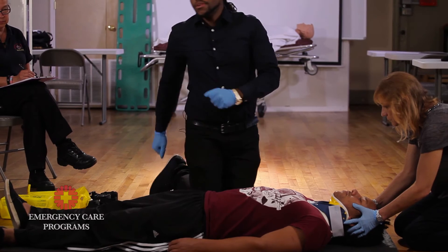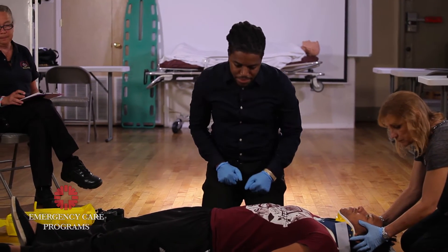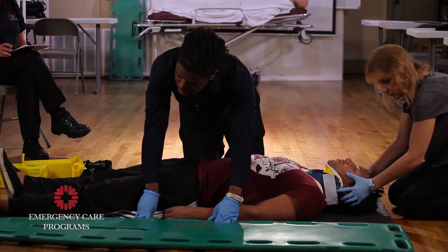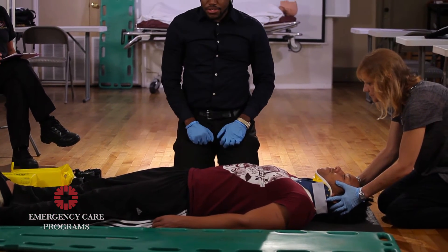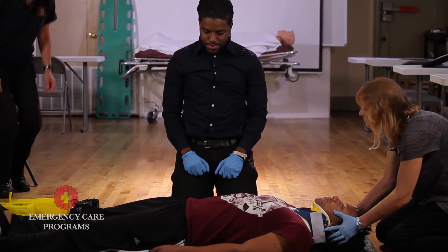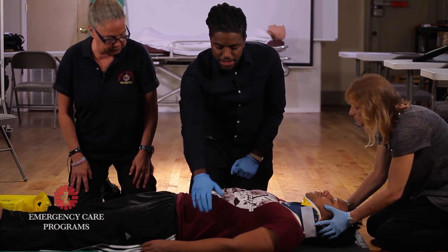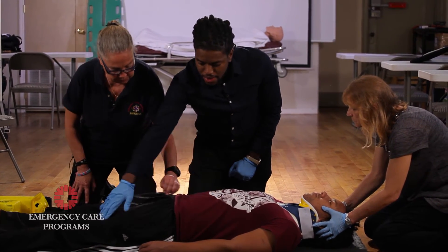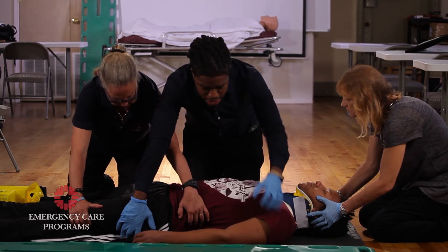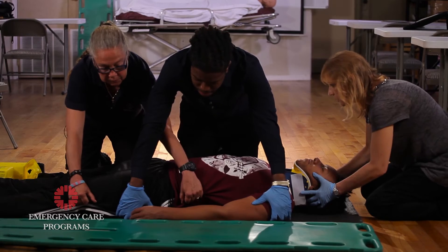At this time, I'm going to measure and put the longboard where I want it to be. Now, using your assistance, I would like to log roll the patient. Can you place your hands on his torso and his upper thigh? On the head person's count, we're going to log roll him toward us. One, two, three.